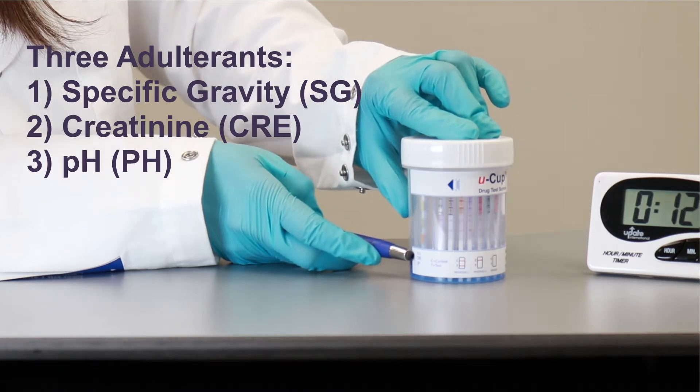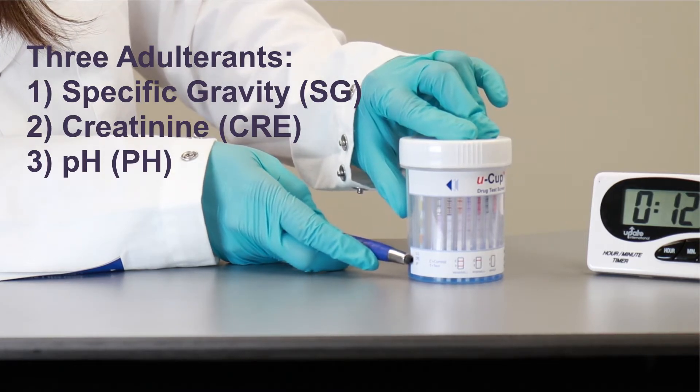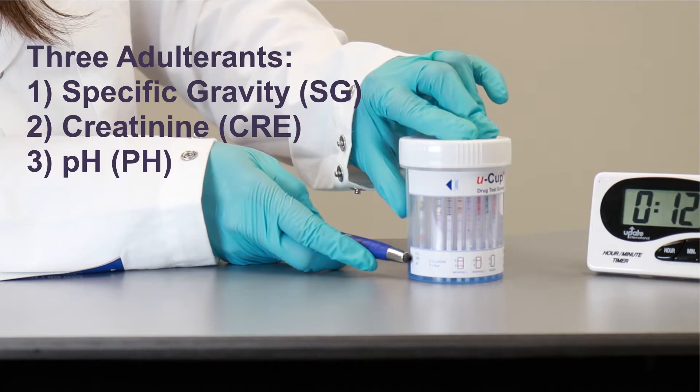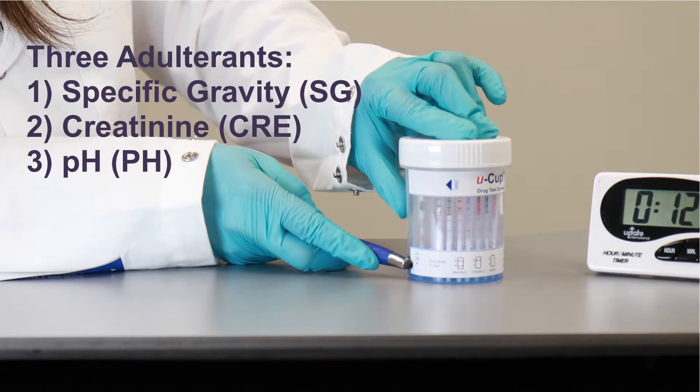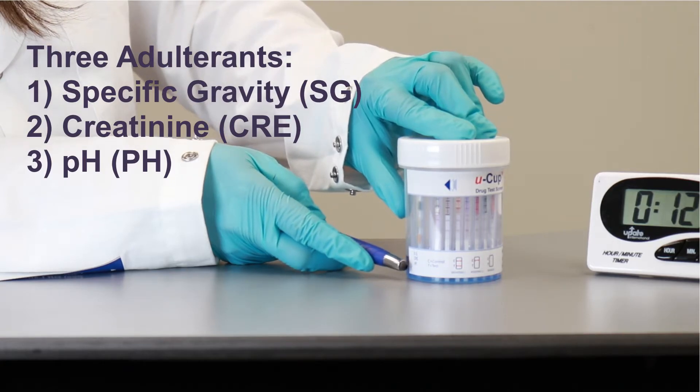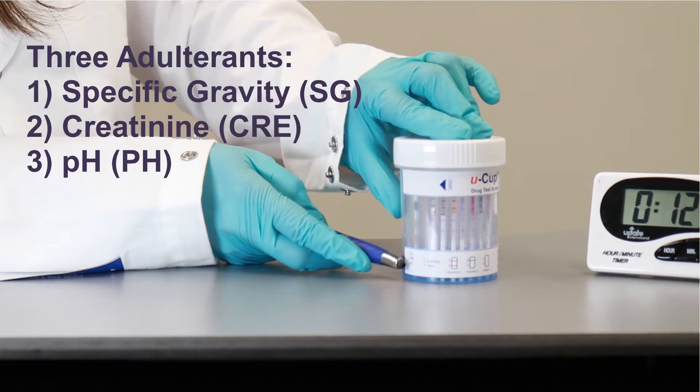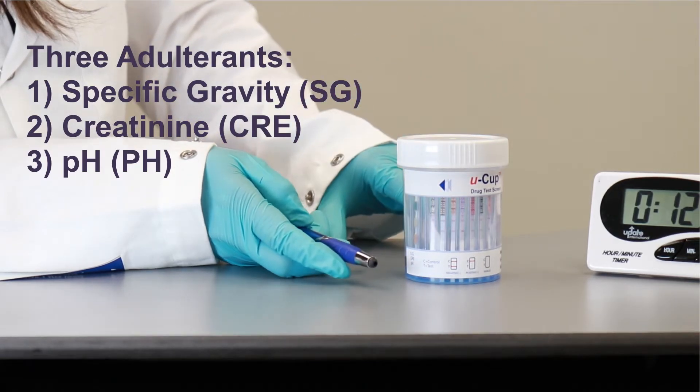And you have creatinine, which is an amino acid that comes from a muscular protein, to be able to tell what the levels are in normal urine. And the pH to make sure there is no adulteration due to oxidants, or any other products that are available to adulterate urine sample.